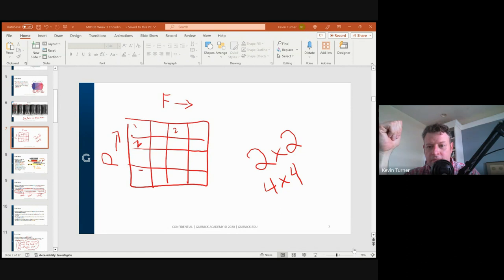To do this, we use steeper and steeper gradients. As I increase that phase matrix and frequency matrix number, the computer says, oh, you need more pixels. That means I need to make stronger and stronger gradients to get those pixels smaller. So increasing the frequency matrix or the phase matrix makes better resolution because those pixels get smaller and smaller. And the reason they get smaller is because when the pulse sequence is running, we are using steeper and steeper gradients. So as the gradients get steeper, resolution improves.